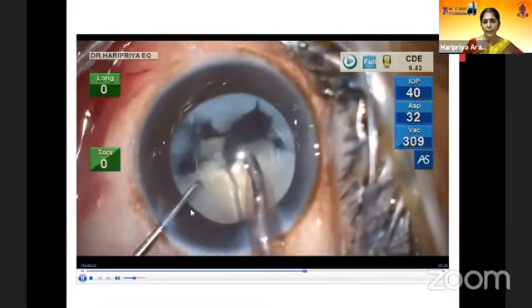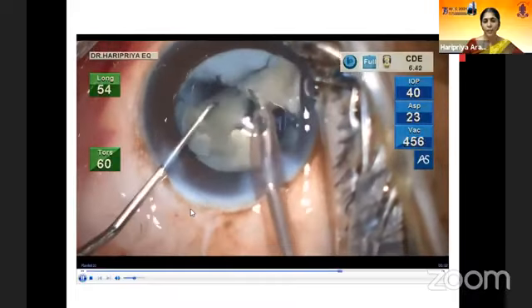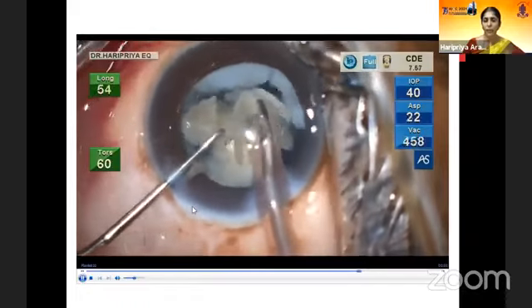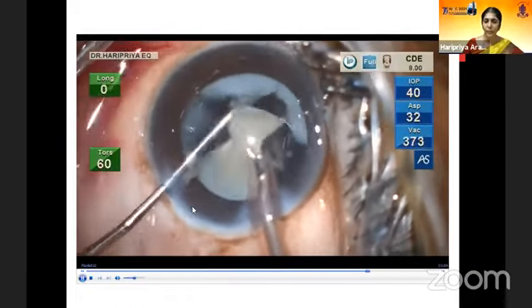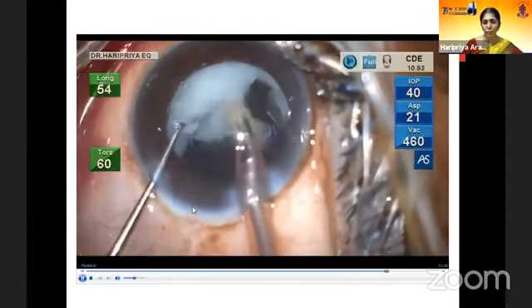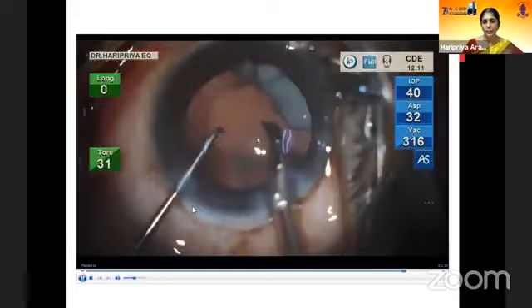Like I mentioned earlier, because of the leakage compensation, the IOP is set lower and the vacuum and flow rate are still the same. So there's actually no difference from what I was doing earlier. I have the same comfort, which means there is hardly any learning curve involved, while giving a safer atmosphere and better comfort to the patient.